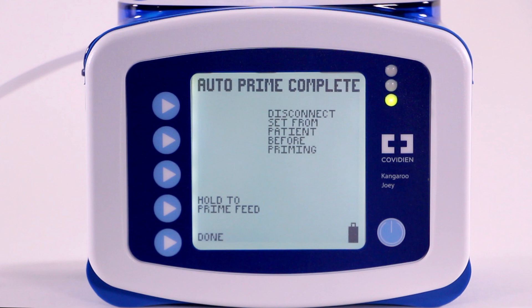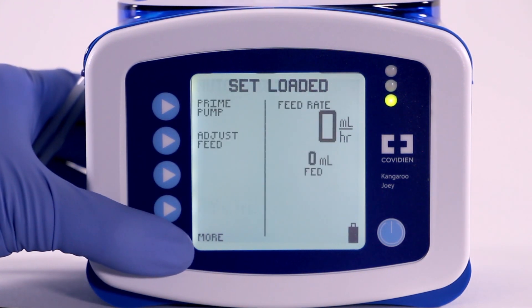To ensure that the line is fully primed, use the Hold to Prime option to complete the priming. Once complete, select Done to return to the main menu.